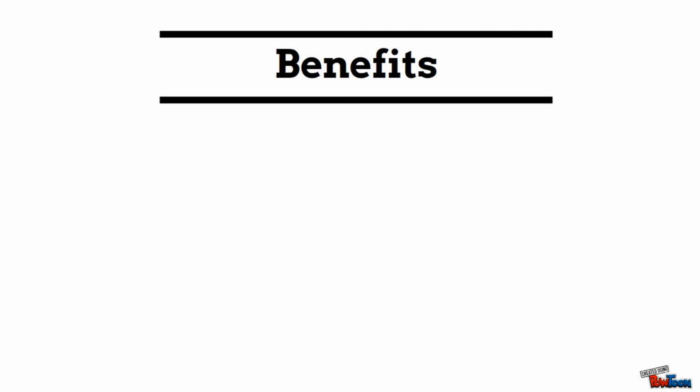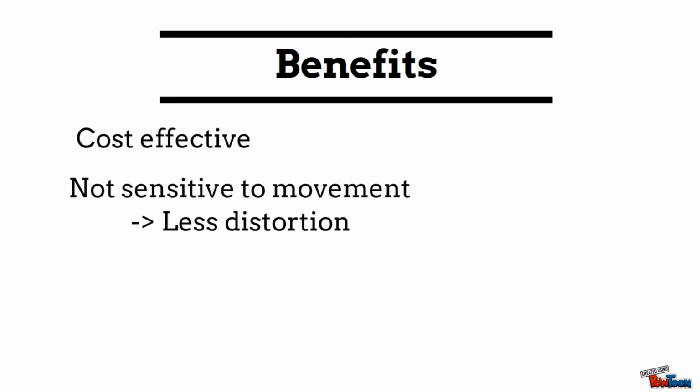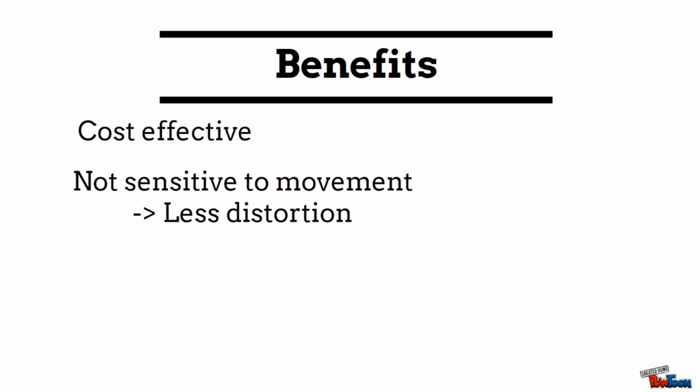The benefits of CT scans are as follows. CT scans are cost-effective. Unlike MRIs, they are not sensitive to patient movements, so there is less image distortion. They have high applicability, and therefore are recommended for patients with implanted medical devices. They can save many lives in emergency situations, as they can easily identify any internal injuries.